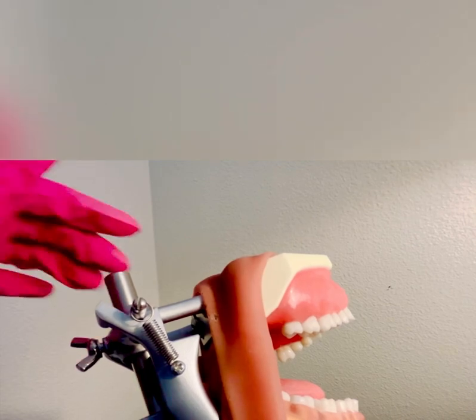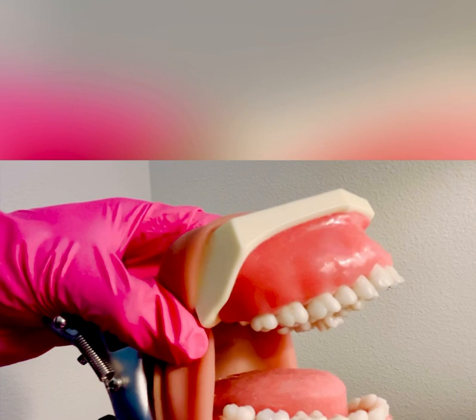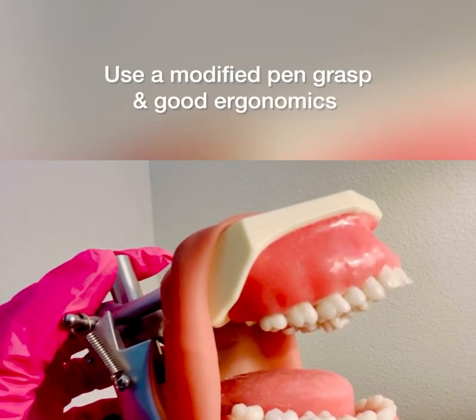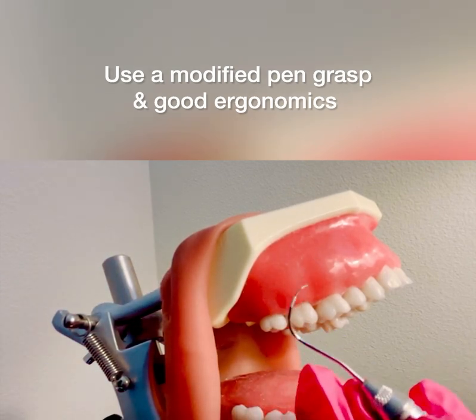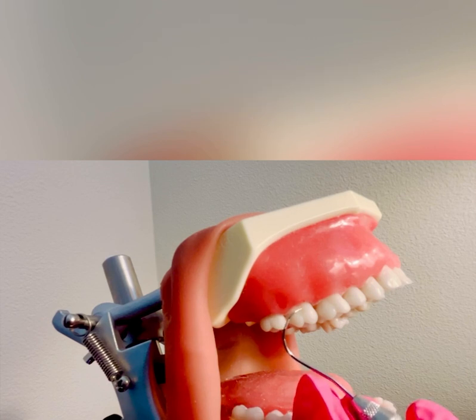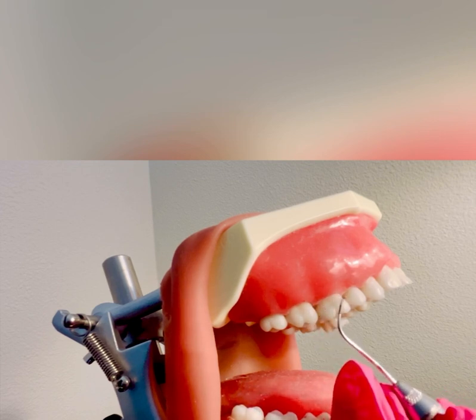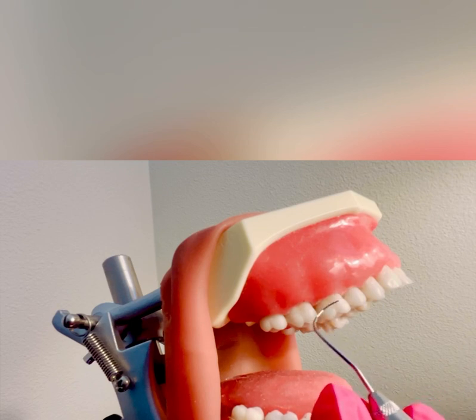I'm going to demonstrate on the typodont now and assess tooth number three. You can still use a modified pen grasp, with an extra oral fulcrum, finding the correct working end. I know this is the correct working end because I can roll and it adapts nicely into the tooth. If I flip it and hold the Nabers probe on the facial surface, you can see the tip is not adapted and it's coming away from the tooth surface.